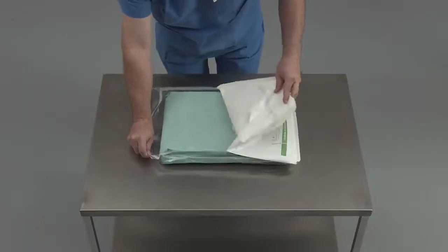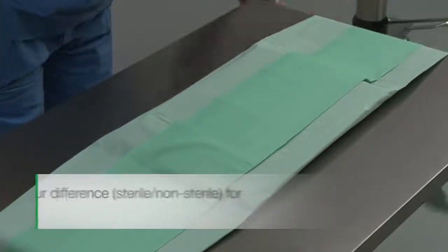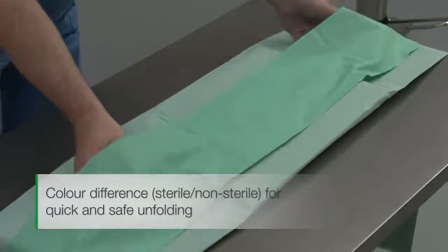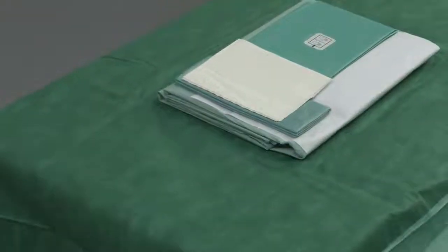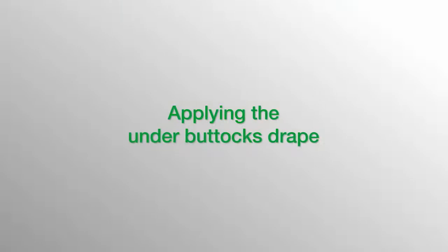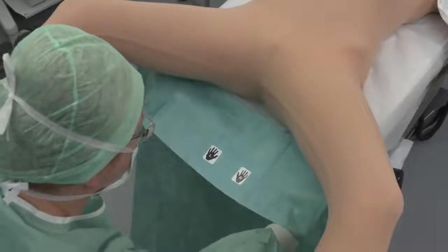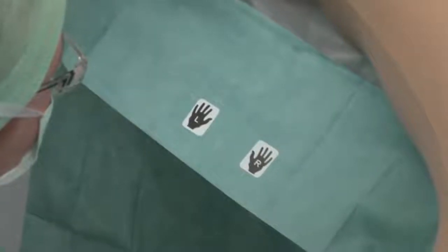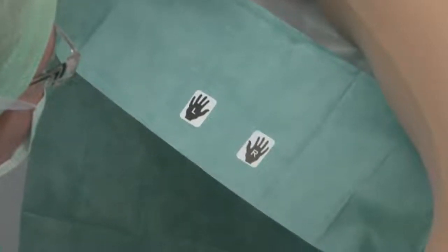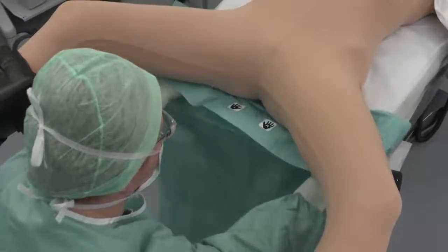Getting started with opening the set. The color difference between the sterile and the non-sterile sides makes safe and quick unfolding easier. In the first step, place under the patient's buttocks. The pictogram shows how the hands are to be positioned when applying the drape. The safety fold further protects OR gloves when applying the drape.